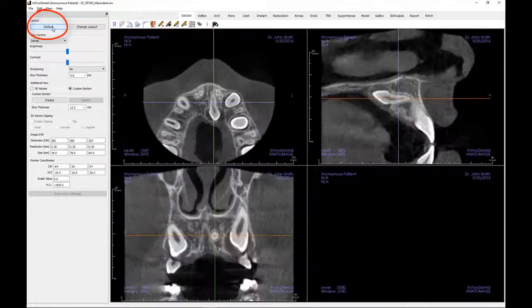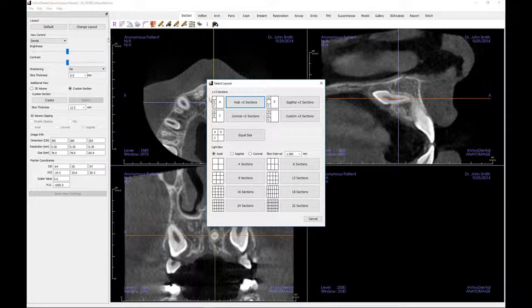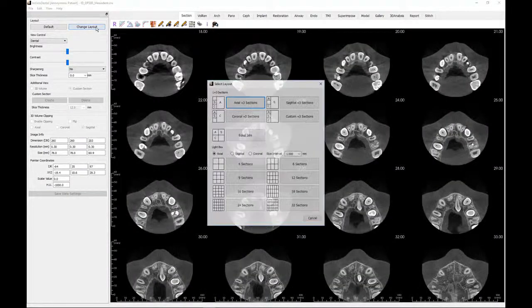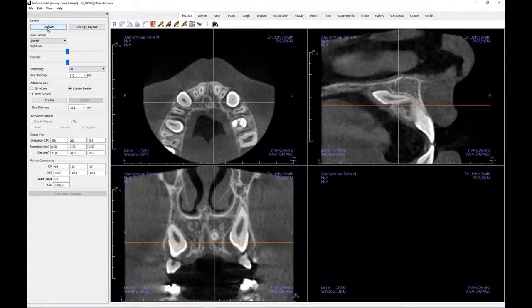You may also choose a lightbox style format. The lightbox is composed of 4 to 32 sections or slices of either Axial, Sagittal, or Coronal views. The user may also define the slice interval by selecting a drop-down option with a thickness range between 0.1 to 20 millimeters, or by manually entering a number within the interval on the keyboard.